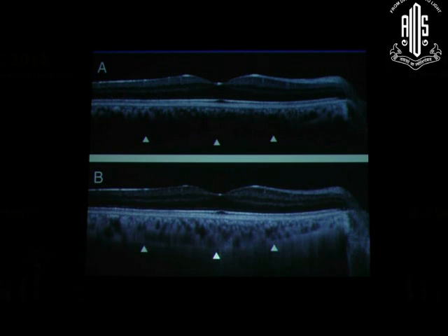So you can actually look at the outer border of the choroid and sclera junction, whereas this is a regular image where you can see that clearly. You do this and invert it manually. There are machines where you can do it automatically. You just click on a button and it does that automatically. If you have that, then you don't have to worry about it. So you can actually see the junction, and really measure the thickness there.